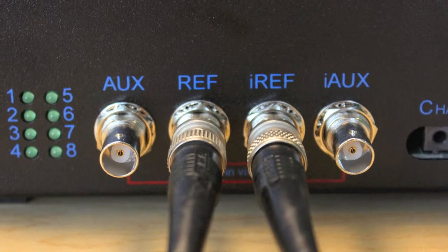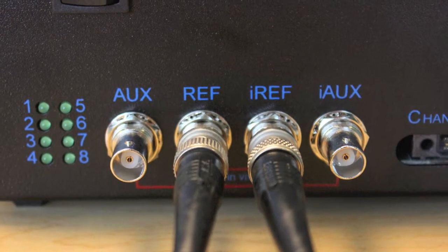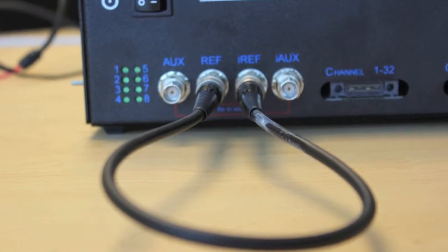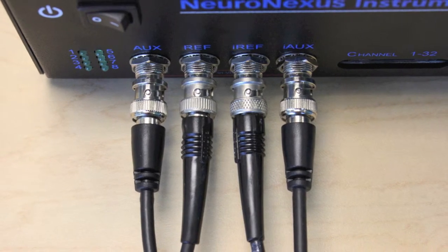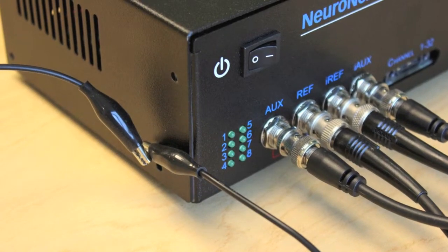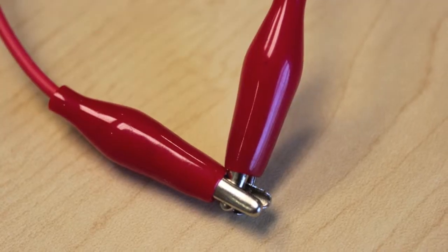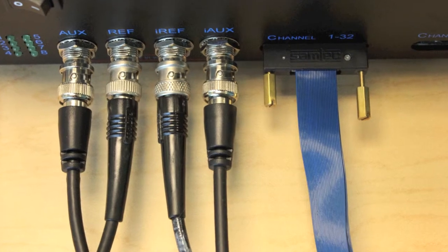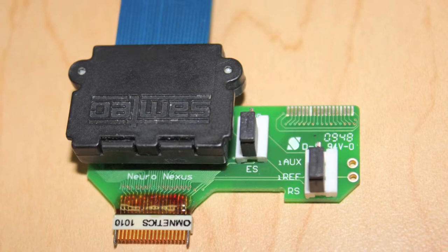You can use a BNC to BNC connector to short the REF and IREF pins. Use BNC to alligator connectors for the AUX and IAUX by clipping the black ends to the Nipod body and by clipping the red pins to each other. Then plug the blue cable into the 1-32 slot and onto the probe adapter.